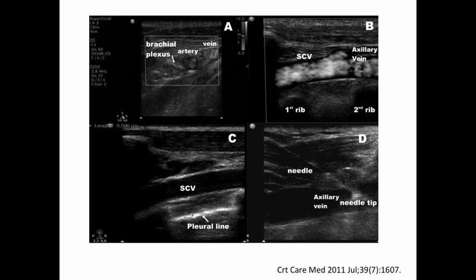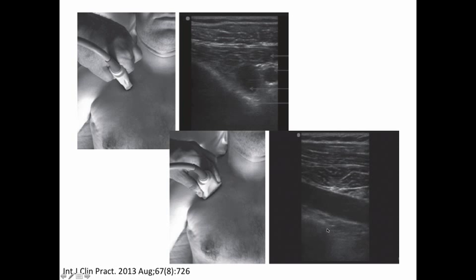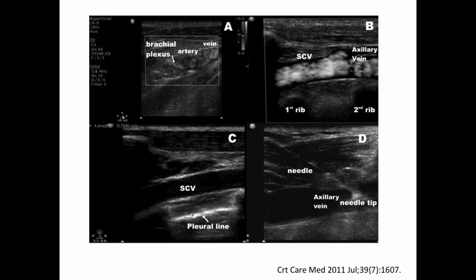Yeah, so in fact, if you go back, there's the bright line that's labeled in that image. Isn't that the pleural line? Yeah, actually, sorry, I got disoriented. This is another example, and I put this one up specifically for that as well, because you can see the pleural line. And you can measure the depth of where your pleural line is, so you should know that if you're going beyond that depth, you're running high risk of a pneumothorax.